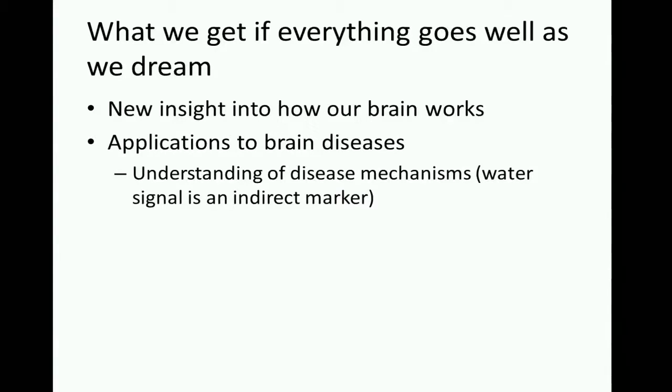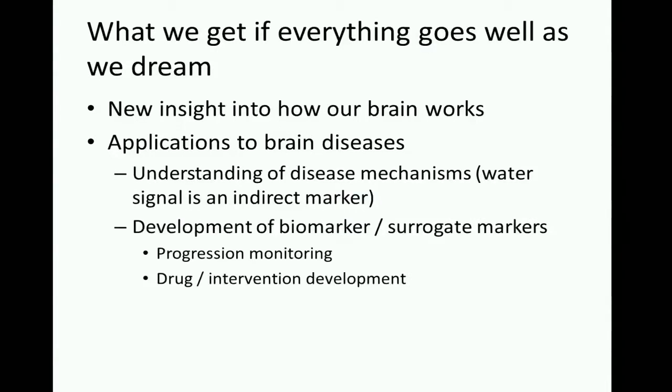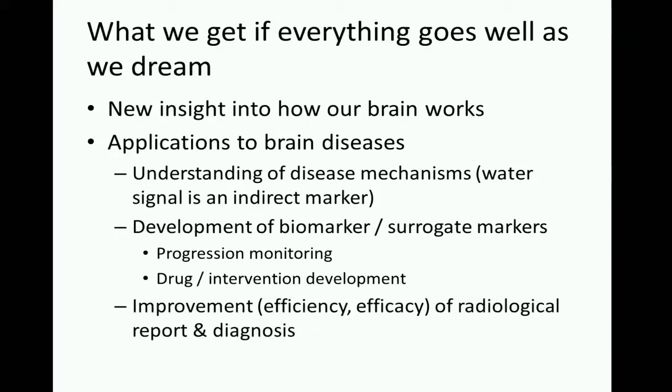So we really have to combine with other modalities to get a conclusion, usually. But that's okay if we want to develop a biomarker, surrogate marker to monitor progression of the disease, evaluate the efficacy of drug intervention. But today, I really want to talk about improvement of radiological report and diagnosis.